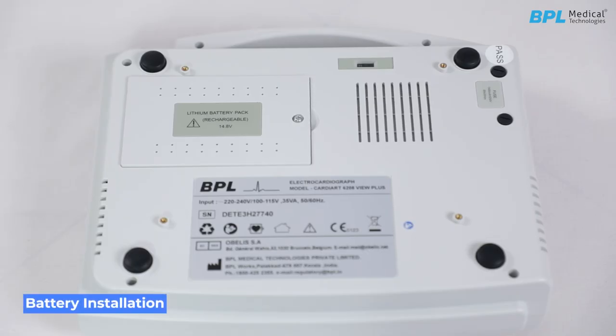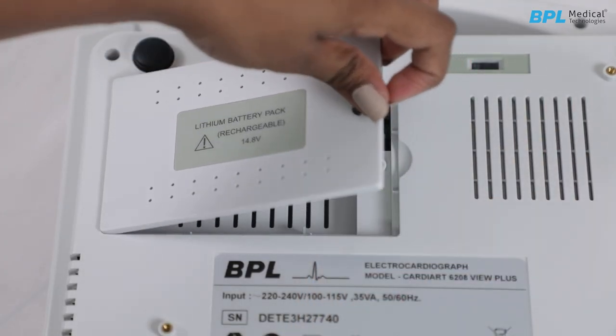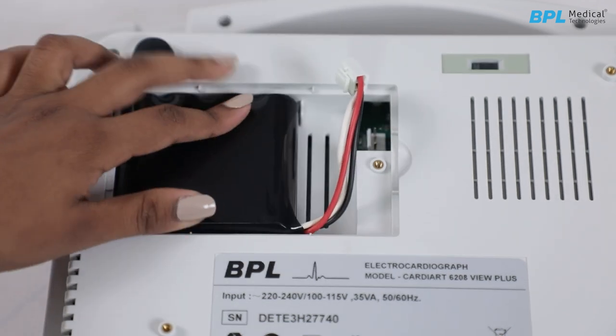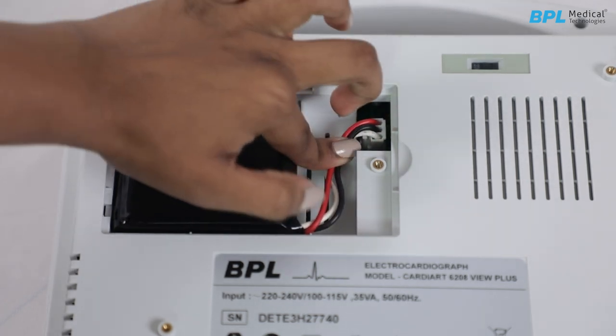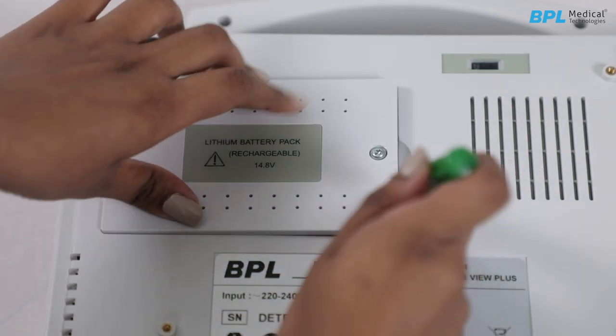Installation of the battery. The unit is shipped with the battery plug disconnected; it must be connected and charged before using the ECG. To install the battery, remove the screw and lift out the battery cover. Plug the polarized connector into the compartment and ensure it locks in place. Make sure the battery cable is placed correctly, then place the battery cover back and screw it tightly.